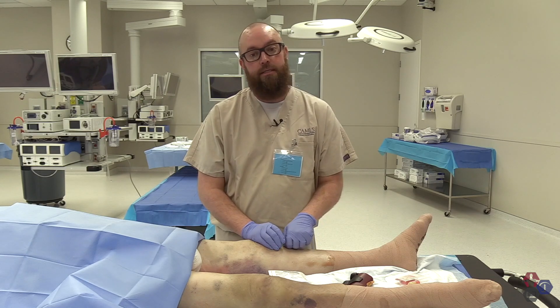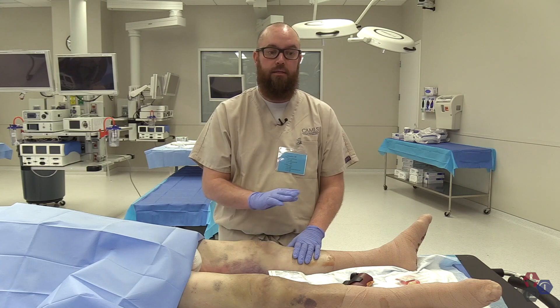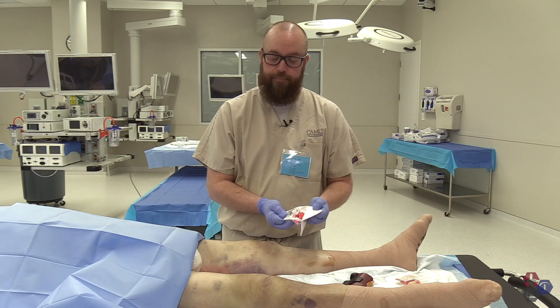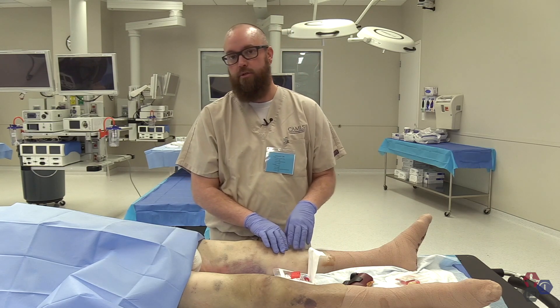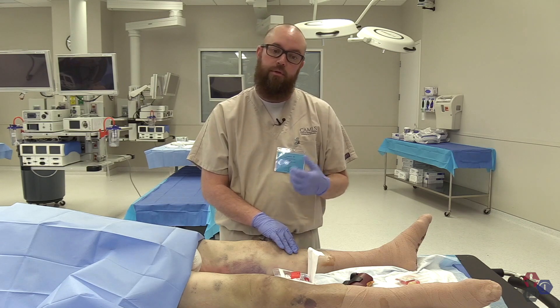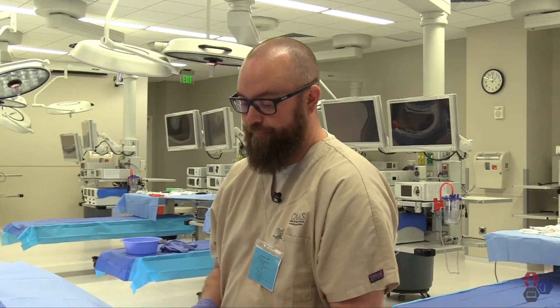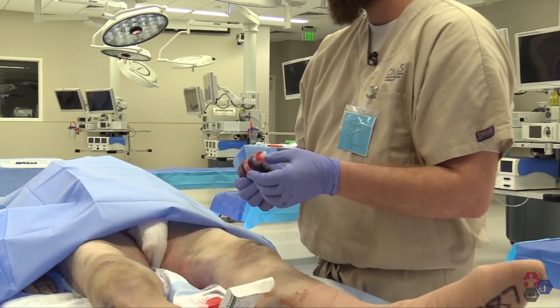Procedure-wise, it is an aseptic technique. You must clean the surface of the placement site before placing an IO. This technique is specifically for the IO driver. There are other methods such as bone marrow needles, but this focuses on the IO driver, which has a special kit designed for use. The needle attaches magnetically to the driver.